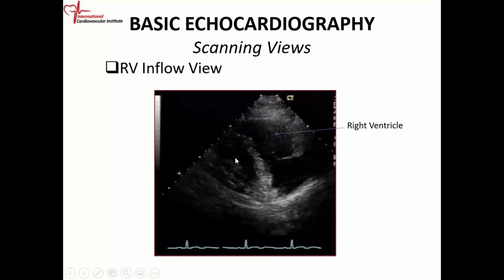When you say rock to the left axilla, you mean like turn the marker to that direction? No, just the head of the transducer, you move it a little bit. So you just tilt it a little bit. You tilt the head of the transducer just a little bit until this view comes up.